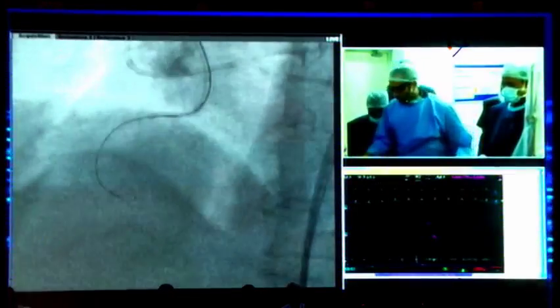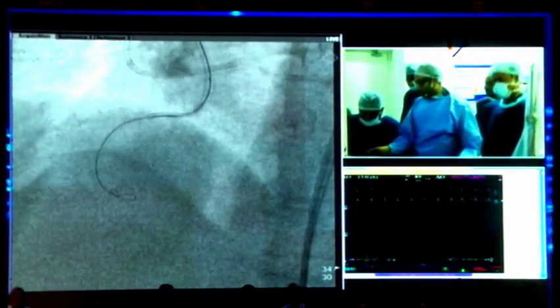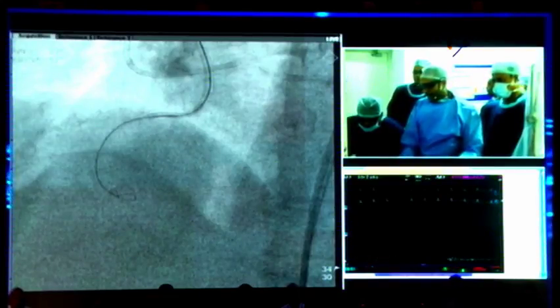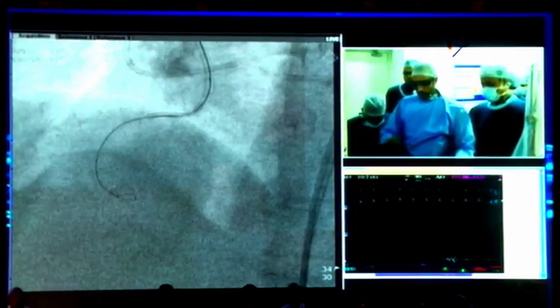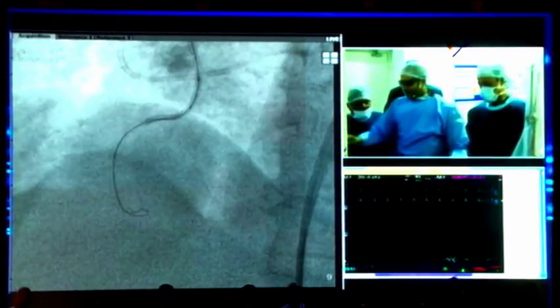Okay, go up. 16 in flight. Okay, now get me the Cross, Jamuna. I want the Cross Boss ready. So 16, Arun is going to show the Cross Boss now. He's going to boss it down to the cross now. So let's see. Guys, just to set expectations, this is probably going to be a 50-50 ADR. It's really diseased distally. So I don't know.